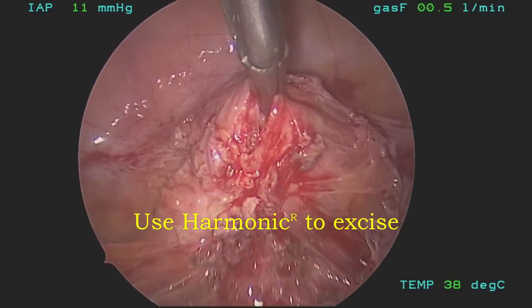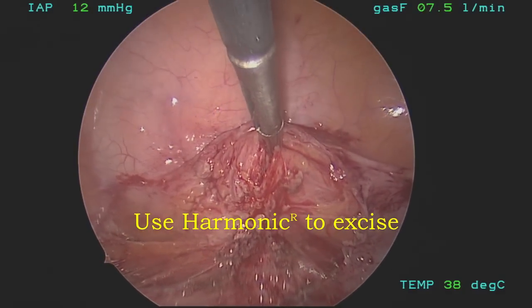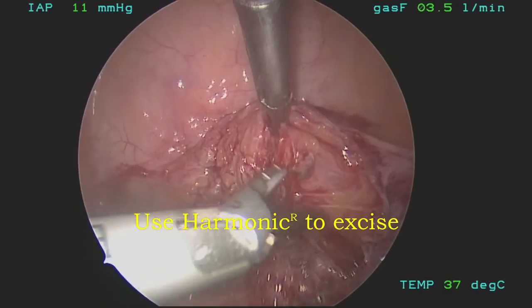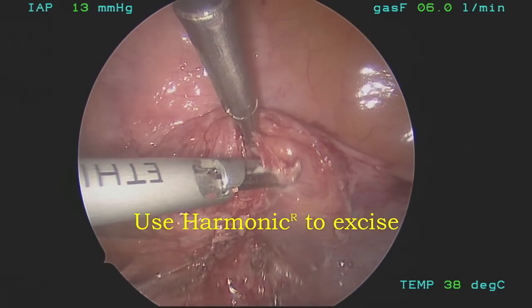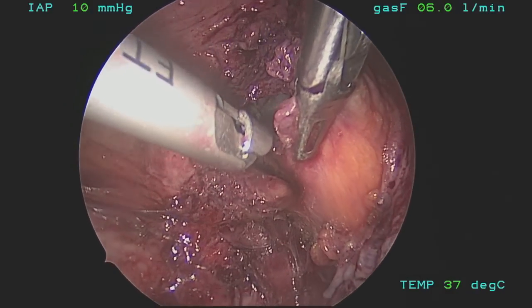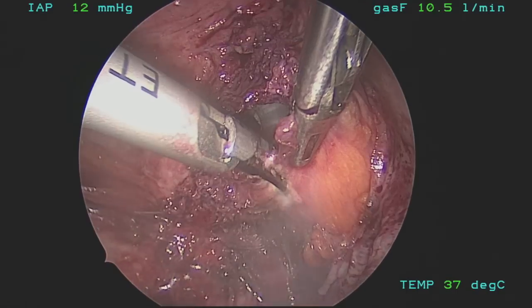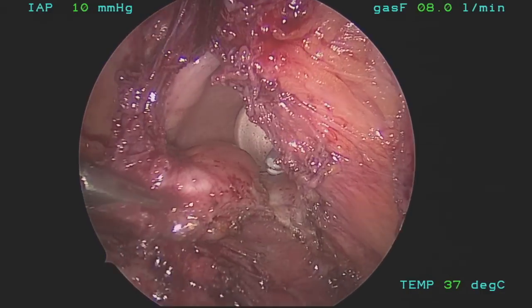Once the bladder is entered, the wall is grasped with an atraumatic grasper. This is a strong dissector. And now the harmonic scalpel can be inserted. I like to use a harmonic energy in this case because it is very clean and there's minimal charring. Now the bladder is entered. The Foley catheter can be seen, and later on the ureteral stents will be seen.